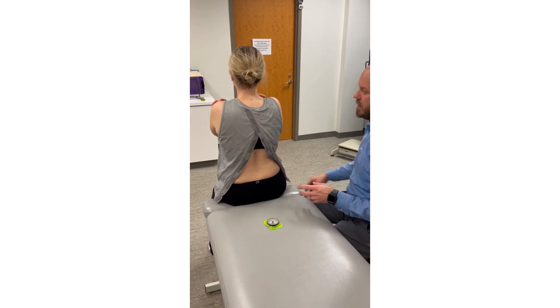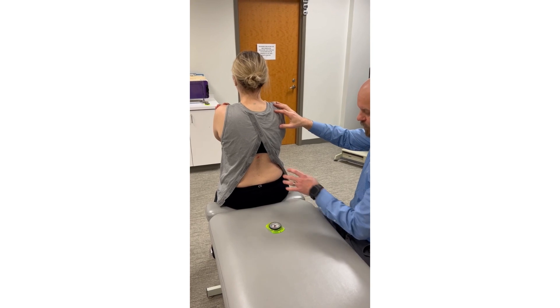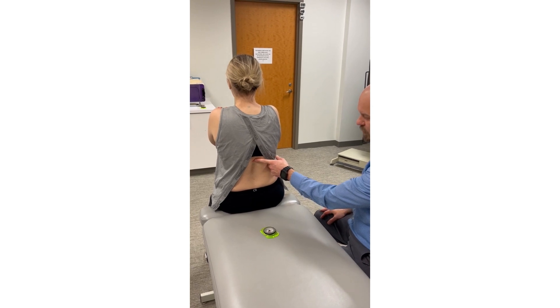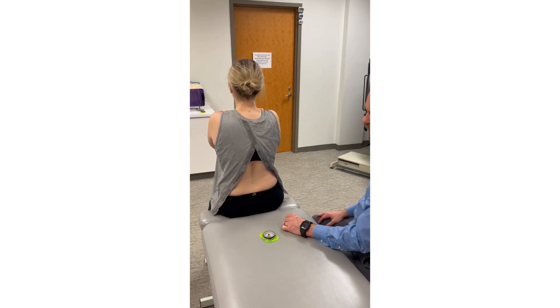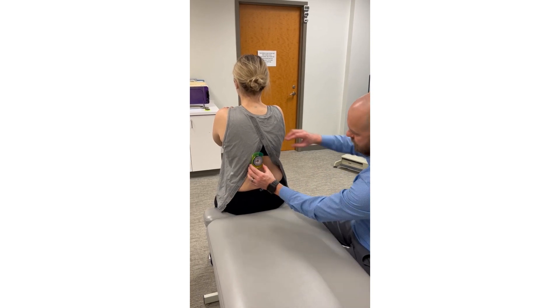Let's measure lumbar spine active and passive lateral flexion, or side bending. We're going to use a single inclinometer for this measurement. The indicator will be placed at T12, which is marked red. Instead of using a reference on the sacrum, we're going to block any substitution from the pelvis by placing my hand on the contralateral iliac crest. We need to zero this out first.